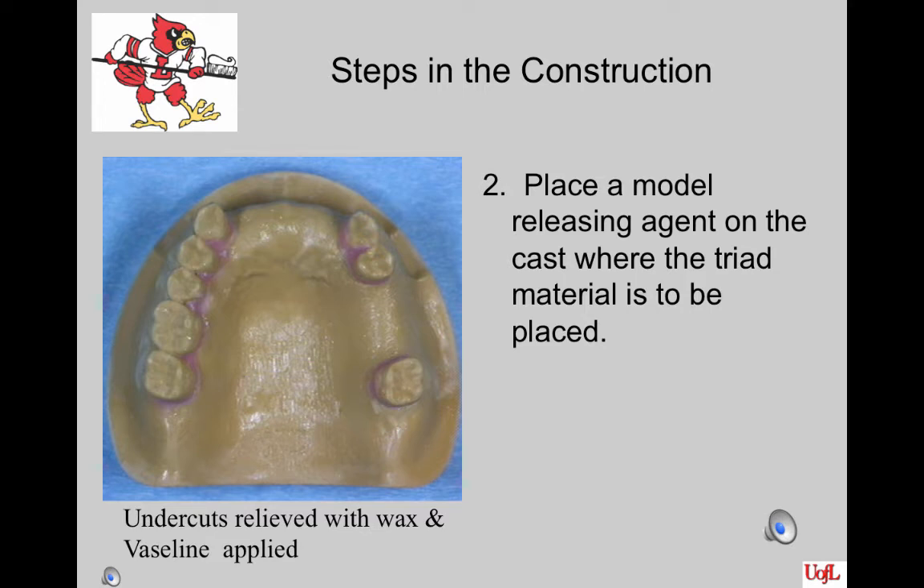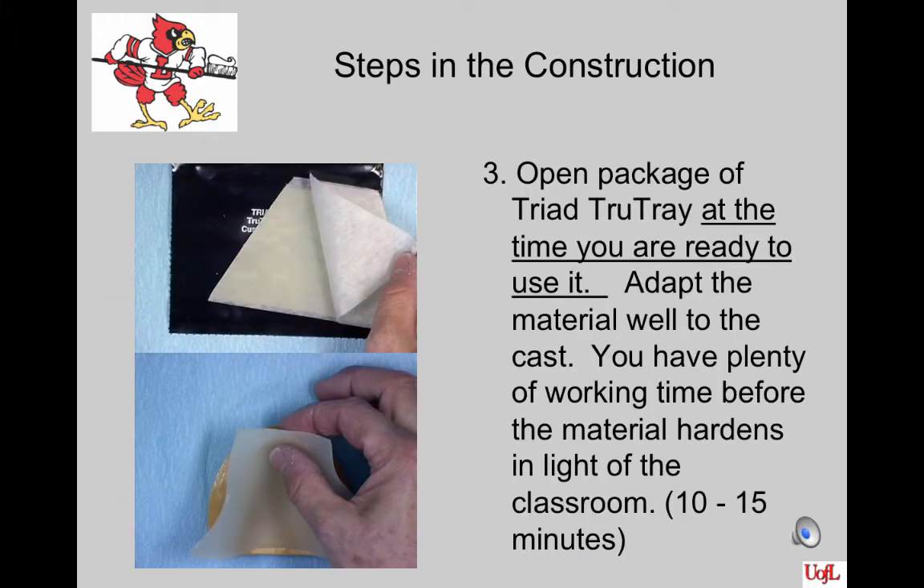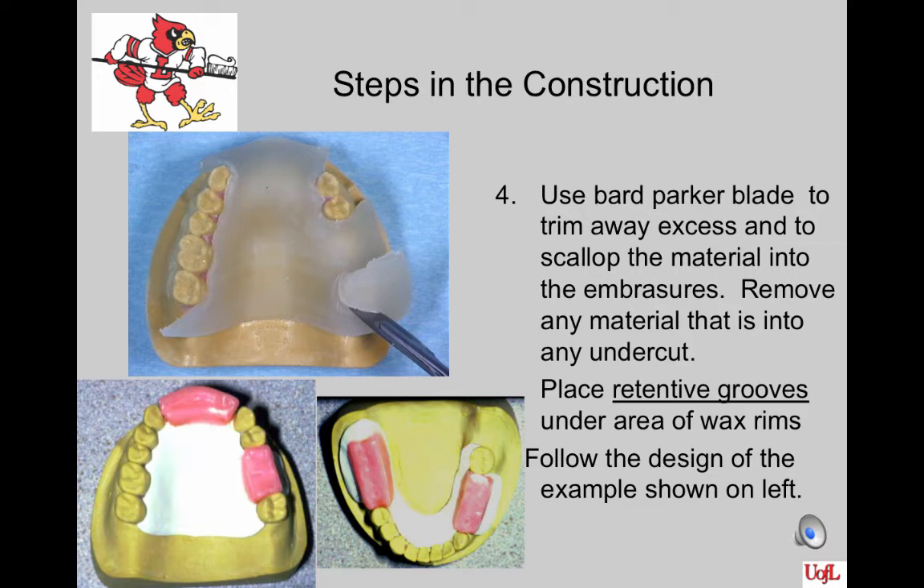Place a model releasing agent on the cast where the triad material is to be placed. We use a thin layer of Vaseline or a couple applications of SuperSep. Open the package of Triad TrueTray at the time you're ready to use it — it will set up in the light of the classroom over time. Adapt the material well to the cast; you have plenty of working time before it hardens. Adapt it to the lingual surfaces of the cast first. Push the triad down on the cast well so that no air is trapped on the tissue side. Make certain that the material is placed on the superbulge of the tooth, above the survey line, and not on the wax.